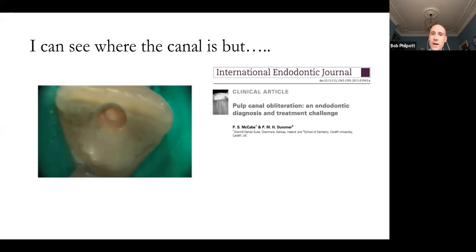So I always have a piece of tissue or gauze. It's weird because I have two different systems. When I treat patients in the EDI, my nurse will hold the gauze for me, or the tissue, so I'll just hold the mirror out. Whereas in the practice, I hold it myself, and you would think that's me being kind of precious, but it's not. It's just how the instrument trays are set up.